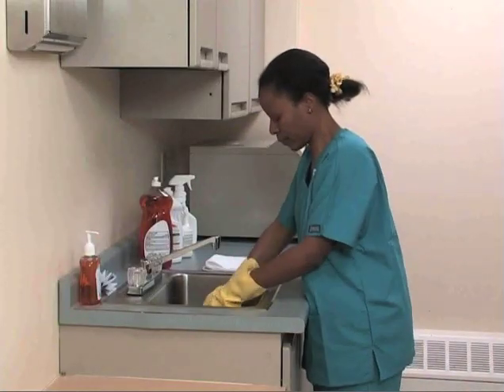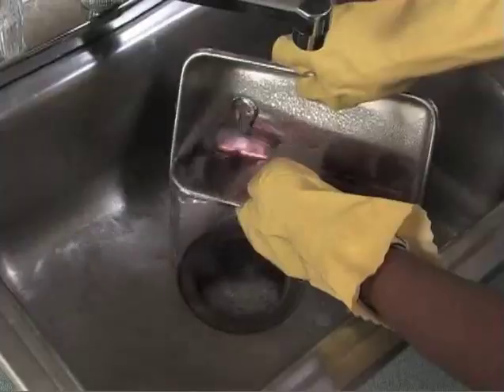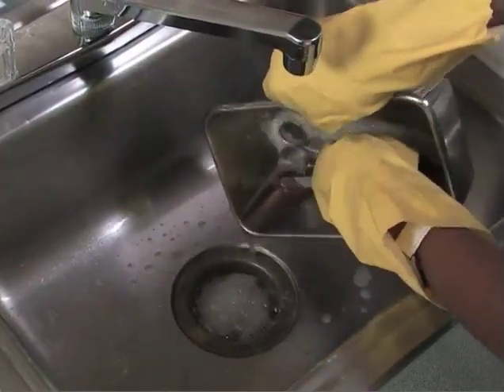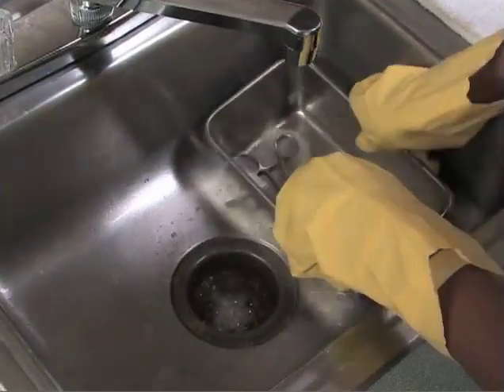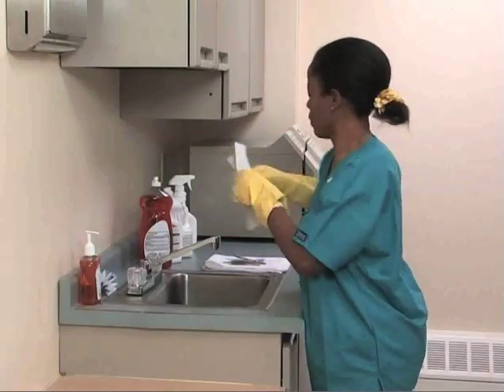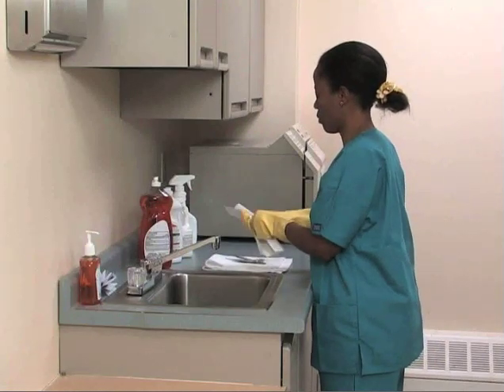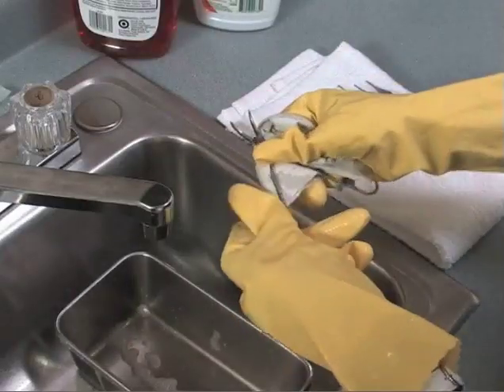Once the instruments have had time to soak, return to the cleaning area and drain off any soapy water or disinfectant. Remove the instruments from the basin. Using a paper towel, carefully wipe away any blood or tissue debris. If possible, hold the instruments by their finger openings.